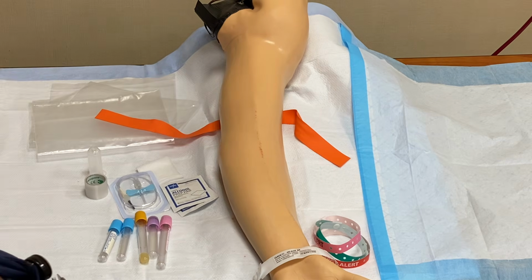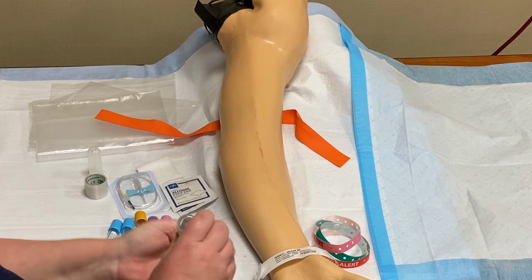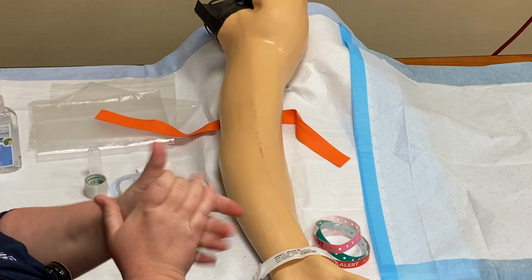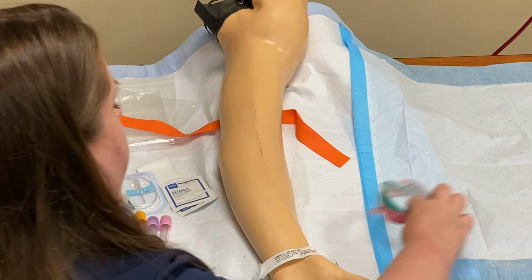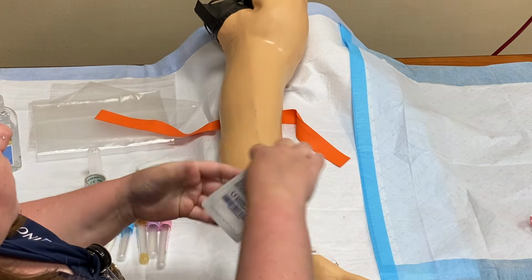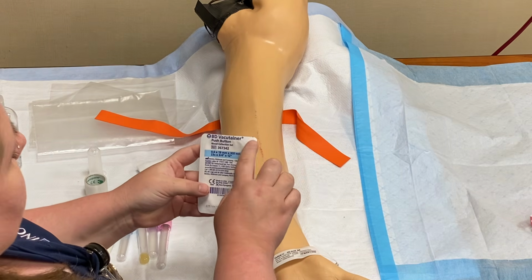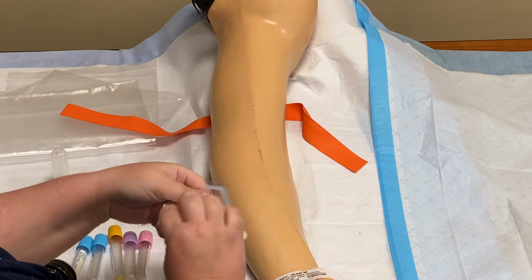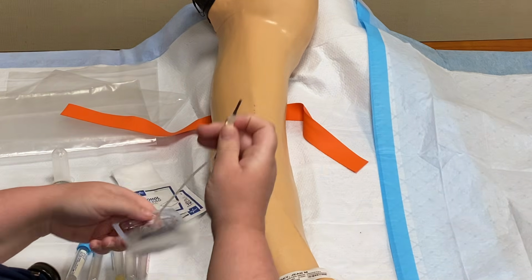So I'll take the tourniquet off. I'm gonna wash my hands, and I will set up my supplies. To open my needle, there's supposed to be a little arrow right here on the back of the package to show you where to open it. So I can open that up and take my needle out.